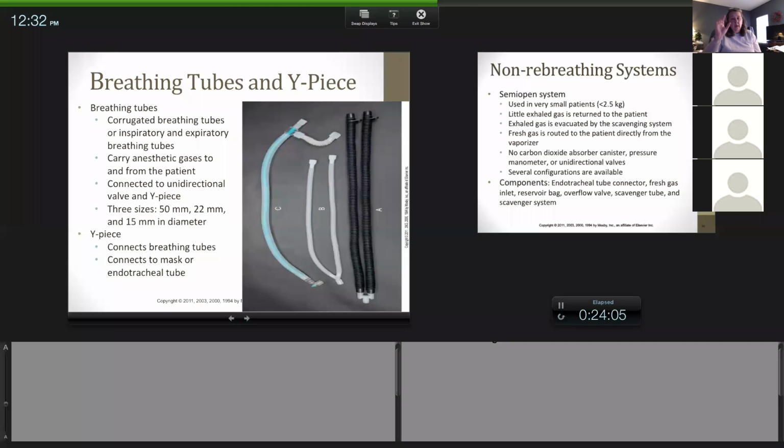Let me give you a tip. If you have a patient that has a very high inspired CO2, this happened in my anesthesia group online where we talk about cases: the inner hose was damaged. The patient was exhaling through the outer tube, but there was a crack in the inner tube, so it was able to inhale CO2. It was very hard to discover this. They had to take it apart and then they discovered it. They basically had to trash it.